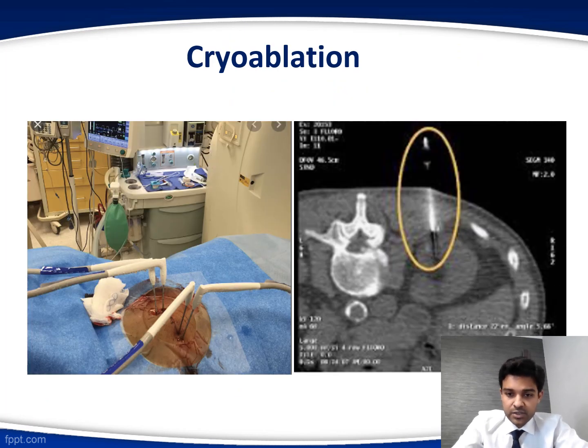Now, in cryoablation, cryoprobes are positioned adjacent to the target in such a way that the freezing process will destroy the diseased tissue. Once the probes are in place, the attached cryogenic freezing unit removes heat from the tips of the probe, and by extension from the surrounding tissue. So the coolant is supplied inside and removes the heat from the tip, and as it does, the surrounding tissue also loses heat and forms an ice crystal which encompasses the target lesion and causes cell death.